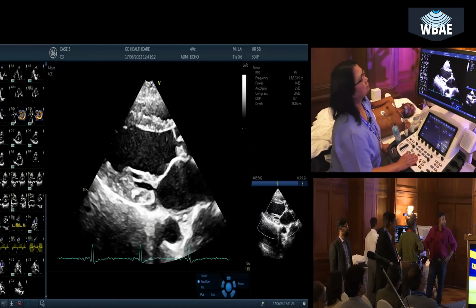This is a pliable mitral valve. You can open it up. Let's have the commissural view in apical 2-chamber. Low gradient, low flow. Apical 2-chamber is a commissural view.